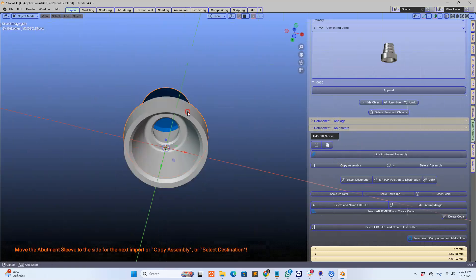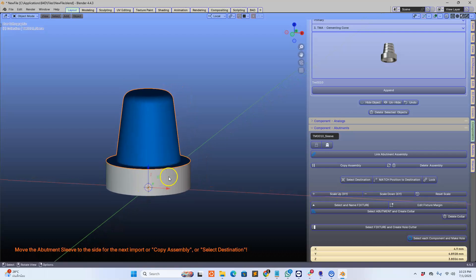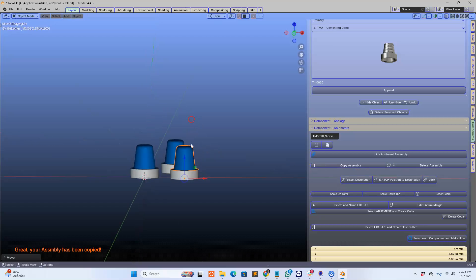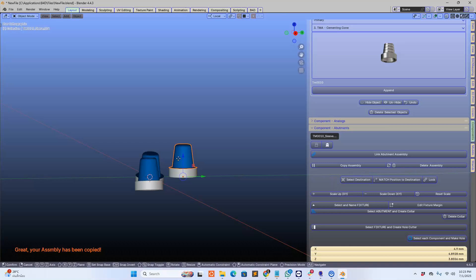Here is a component — this is like a multi-unit abutment — and we're going to copy this another two times. Copy and copy one more time. Now I want to move this sort of like that, and this one like this, maybe this one down a little bit, rotate it a little bit. This wouldn't be a clinical situation, it's just for fun as I've said.